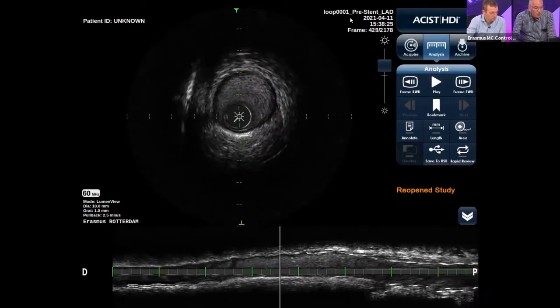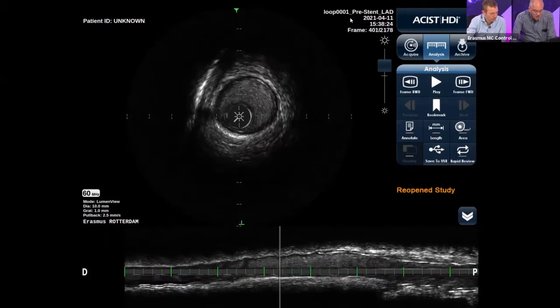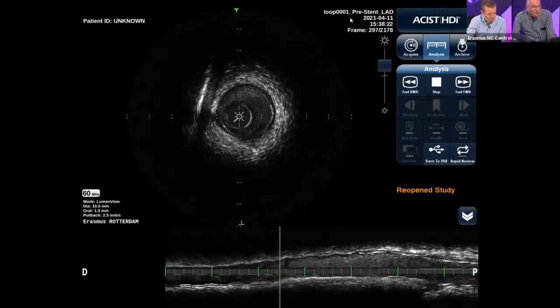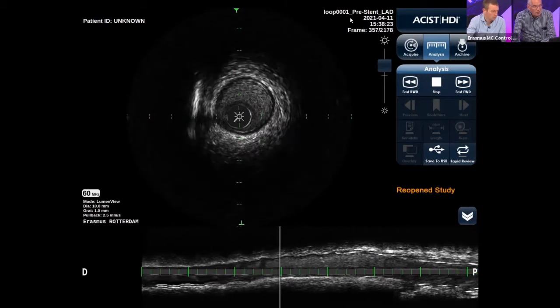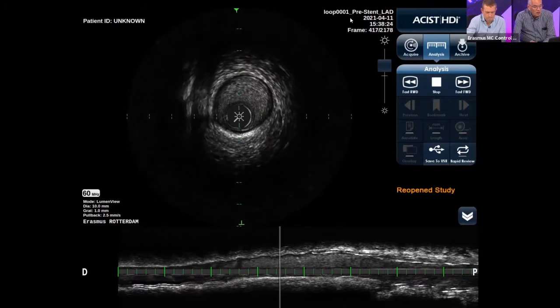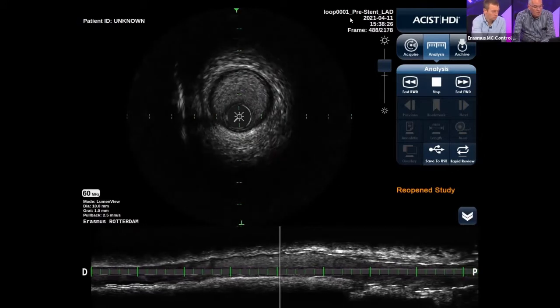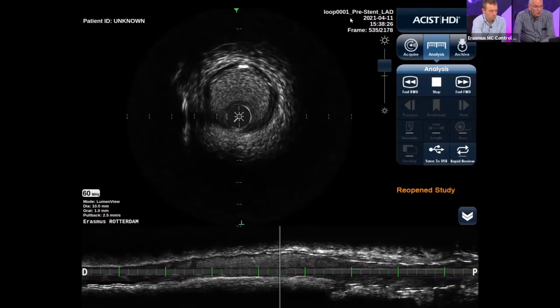Faster moving blood is darker. See darker speckles. Can you put the play button again, Jurgen? Yes, I will do. There we go. Appreciate the difference. Now I'll let it play. You see the difference between the slower, sluggish flow, but normally you have a darker lumen with blood speckling, but definitely darker. And the problem is that we have 2 regions with thrombosis.